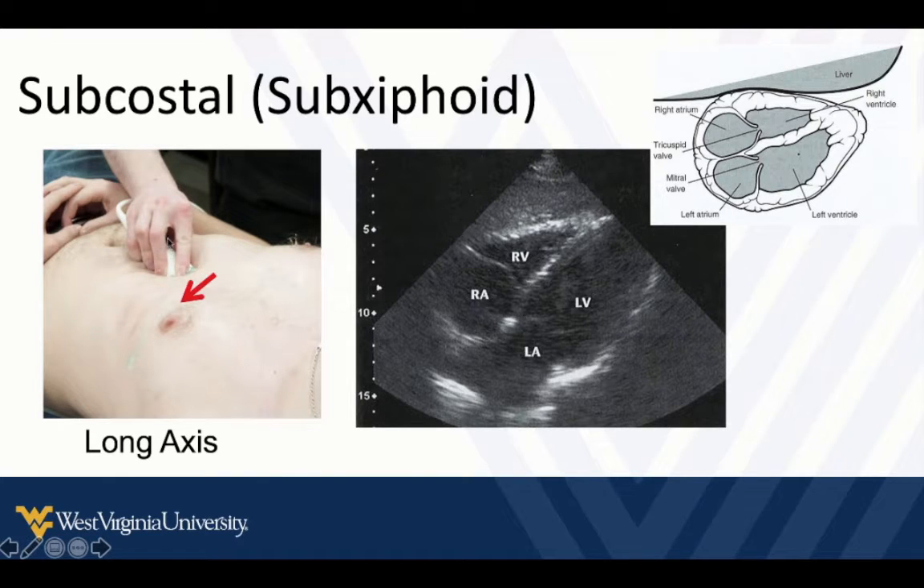That's good positioning of the hand — you can see the hand is all on top. You cannot have any part of your hand underneath your probe or you won't be able to get it flat enough to get a good view of the heart from here. The liver edge is here, apex, base, right, left.